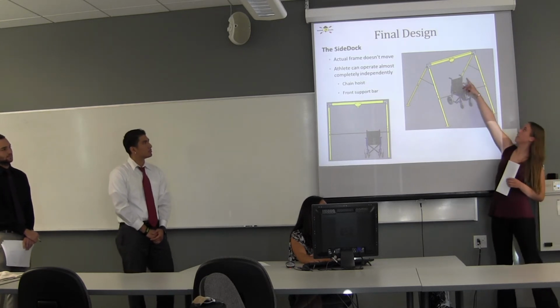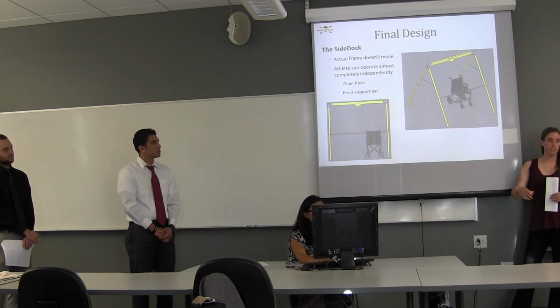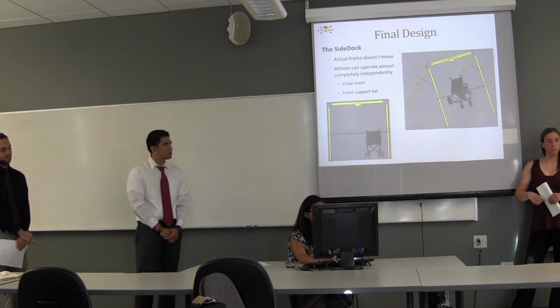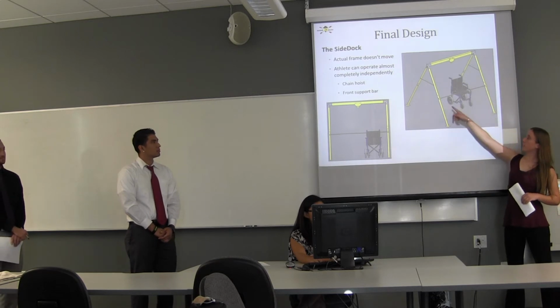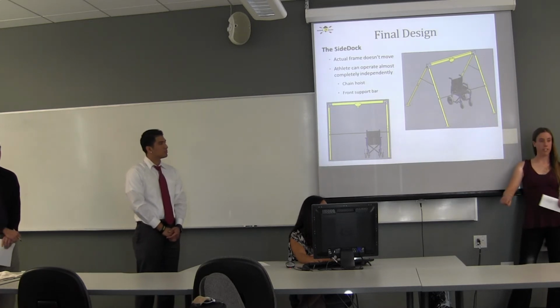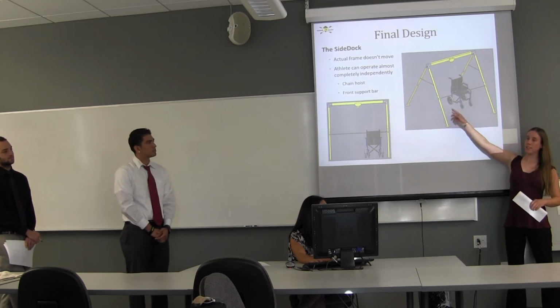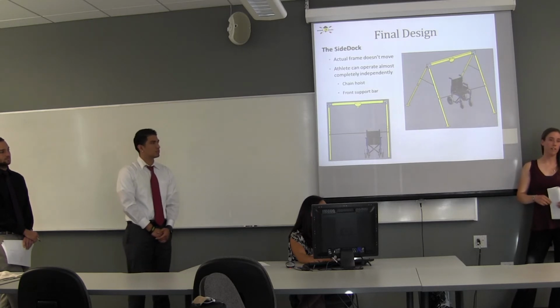Again, there's a trolley up there where there's a chain hoist attached, and there's a sling attached to the chain hoist. And so the person would put themselves in the sling, again, pull themselves up, and then there's a bar in front here where they can hold on to for additional support. And then if they have the strength, they can pull themselves along so that they would be over the kayak, then use the chain hoist to lower themselves into the kayak, and then they'll be ready to launch.